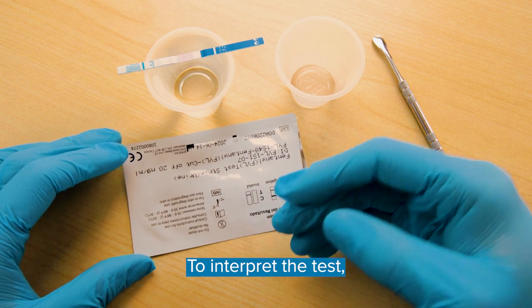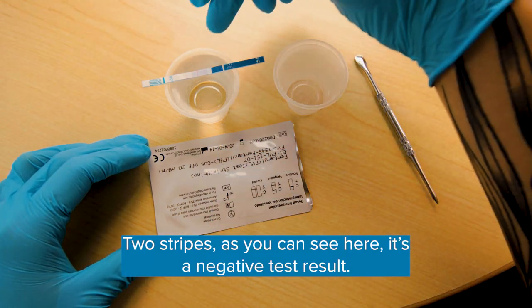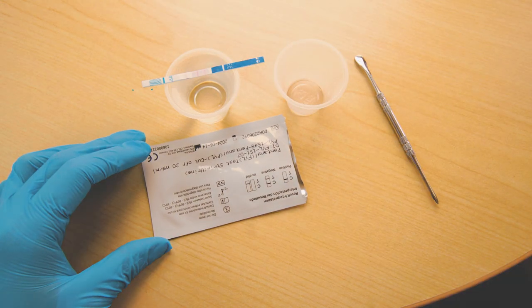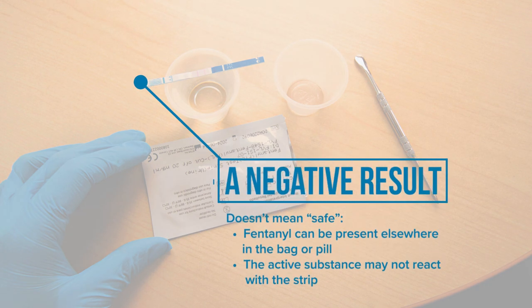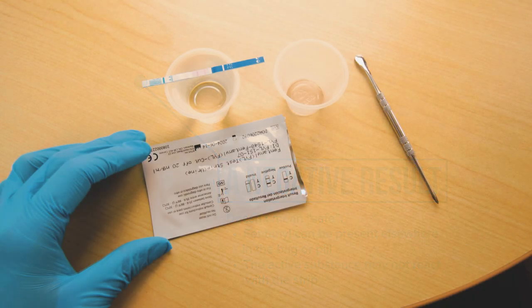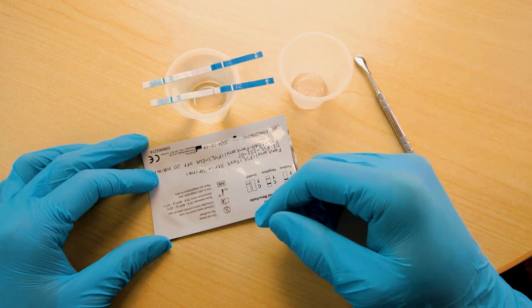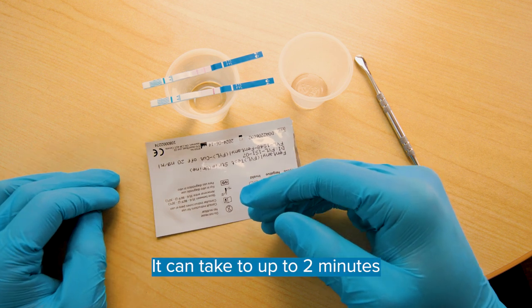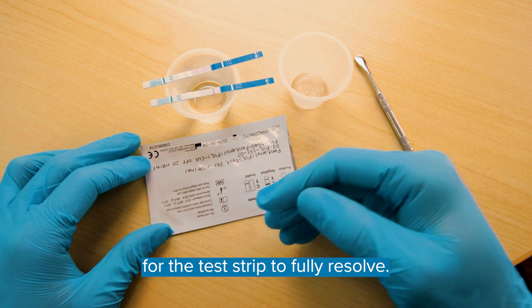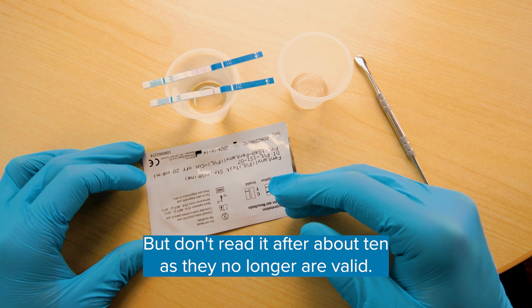To interpret the test, these strips are the opposite of a pregnancy test. Two stripes, as you can see here, is a negative test result. One stripe like this is a positive result. The lines can be very faint, so make sure to look at them under a bright light. It can take up to two minutes for the test strip to fully resolve, but don't read it after about 10 minutes, as the results are no longer valid.